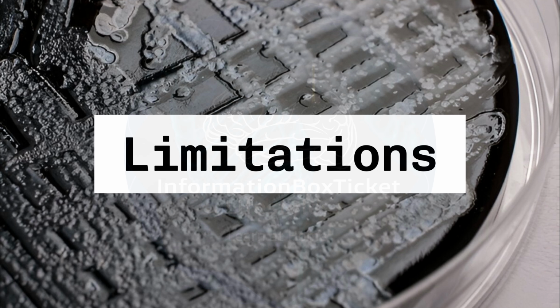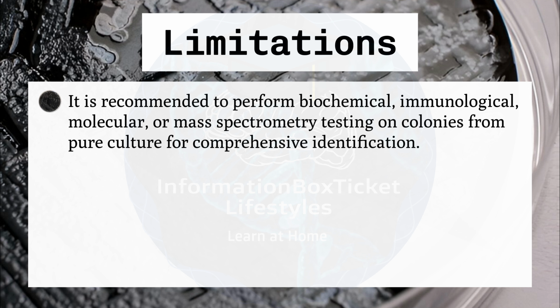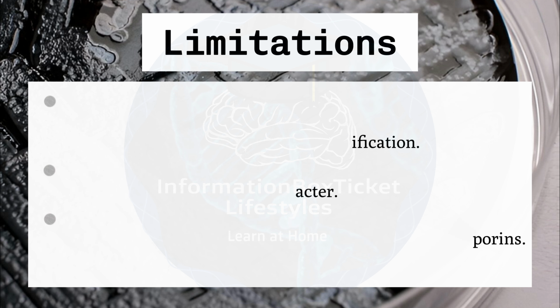Limitations of charcoal selective medium. It is recommended to perform biochemical, immunological, molecular, or mass spectrometry testing on colonies from pure culture for comprehensive identification. Extending the incubation period to 72 hours may enhance the isolation rate of Campylobacter. Campylobacter coli, Campylobacter fetus, and some strains of Campylobacter jejuni may be inhibited by cephalosporins.